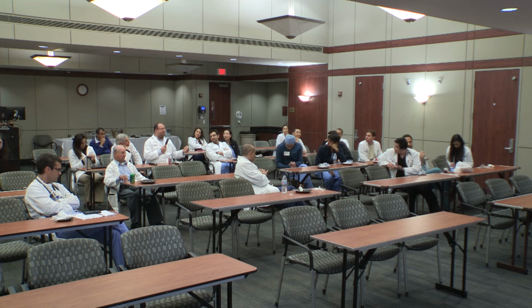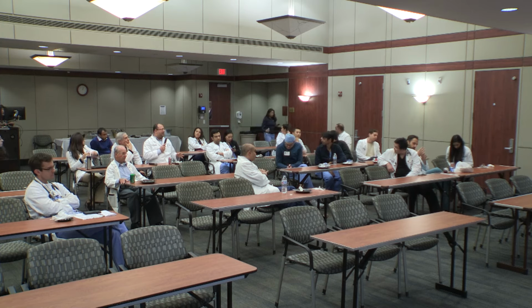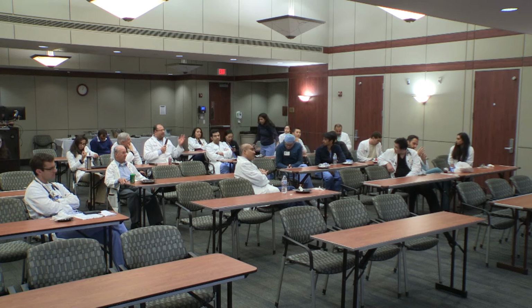If there is a lot of calcium and the patient's symptoms are clear, then either functional testing or cath directly. If the patient doesn't have calcium and you truly believe that the symptoms are not concerning, then you may just stop there or may potentially just get a CTA. So there are things that you need to tweak while you're making your clinical decision for which modality to choose: the route of anatomy versus function versus other imaging versus nothing even.